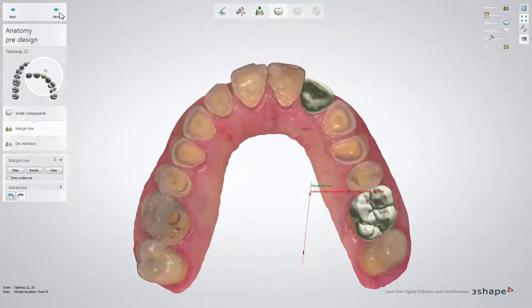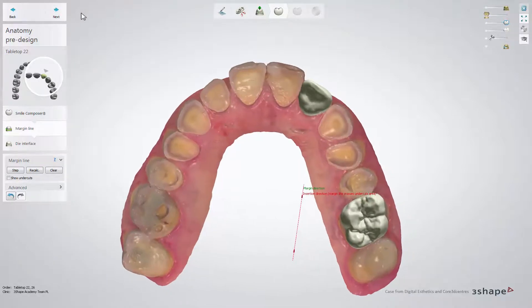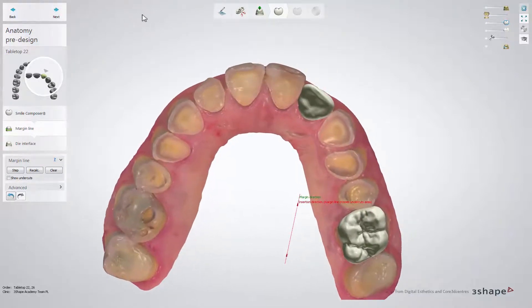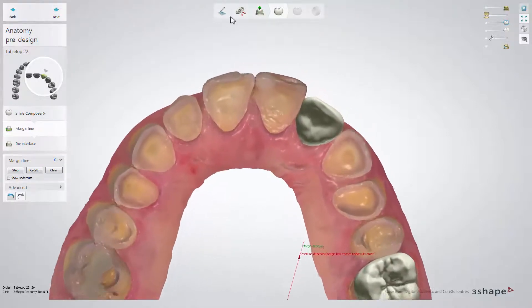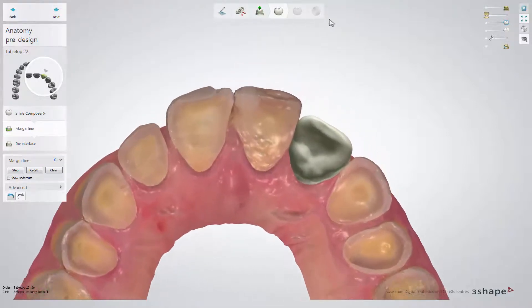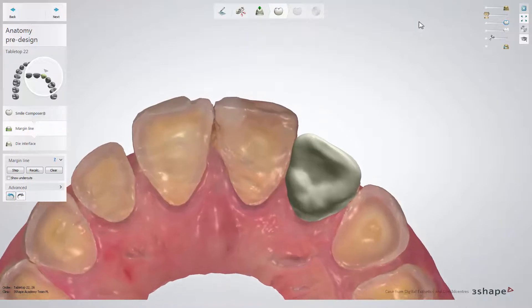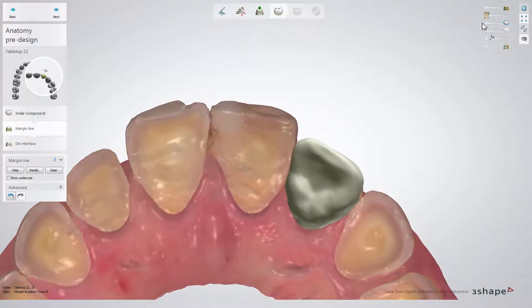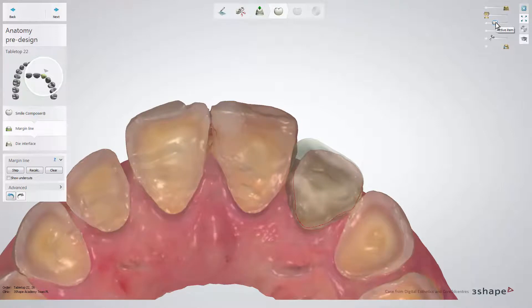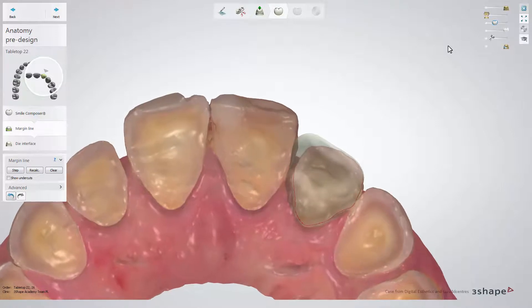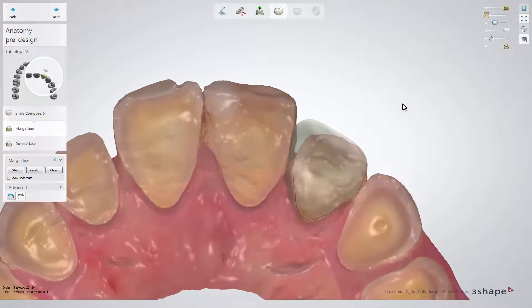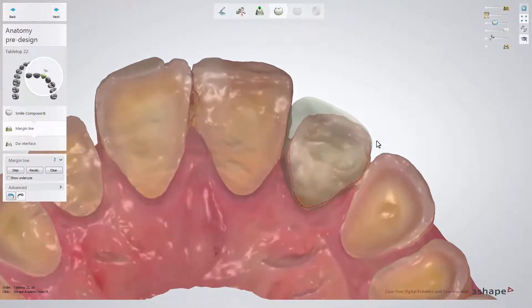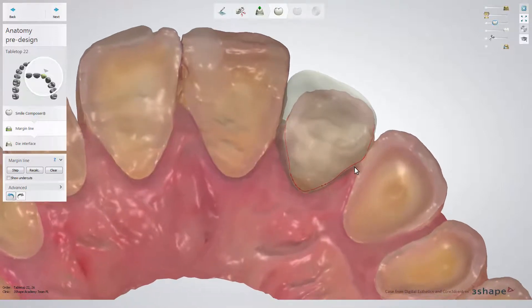Now, in the margin line sub-step, the margin line is automatically placed at the intersection between the anatomy design and the non-prepared tooth. You can adjust the outline of the design to improve its shape and fitting.